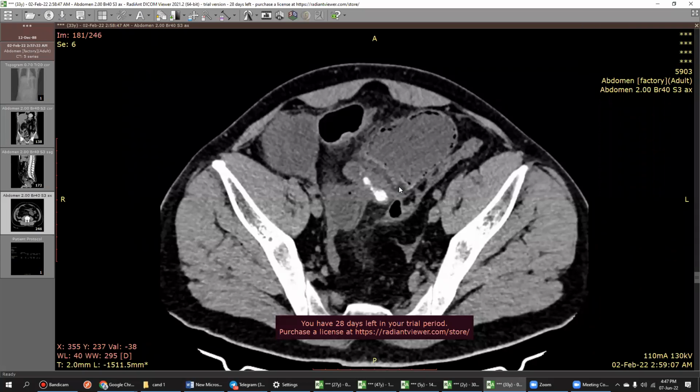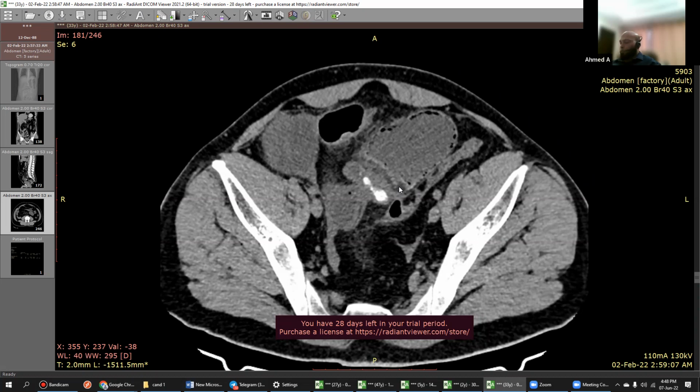So coming back to this abnormality, just for the sake of discussion, if it was a contrast, what would have been the HU value? I think it should have been in the regions of like 600. No, not less, more. Sorry, 600 and above. Yeah, no problem. So what do you think? How do you proceed with the case now?